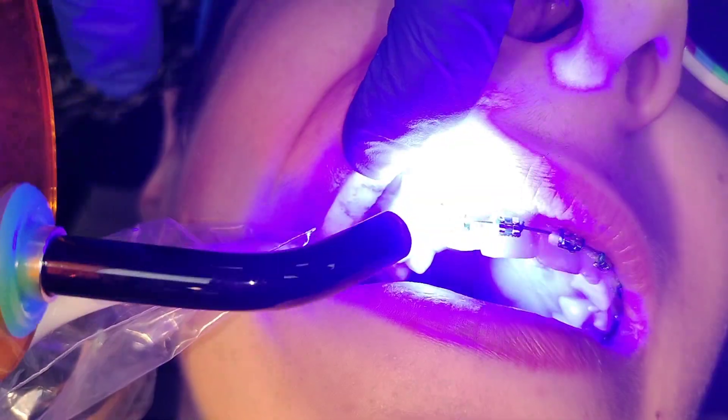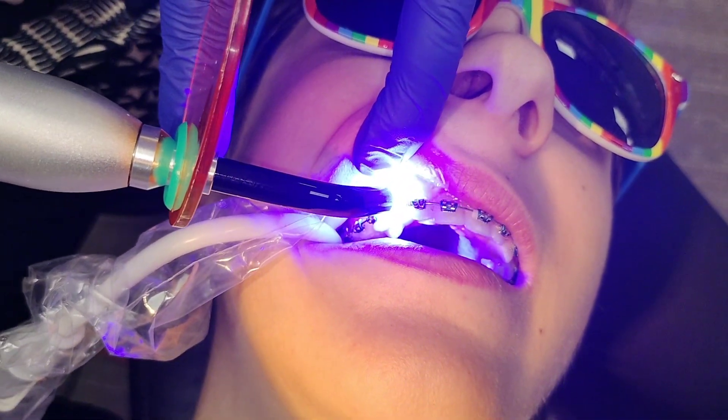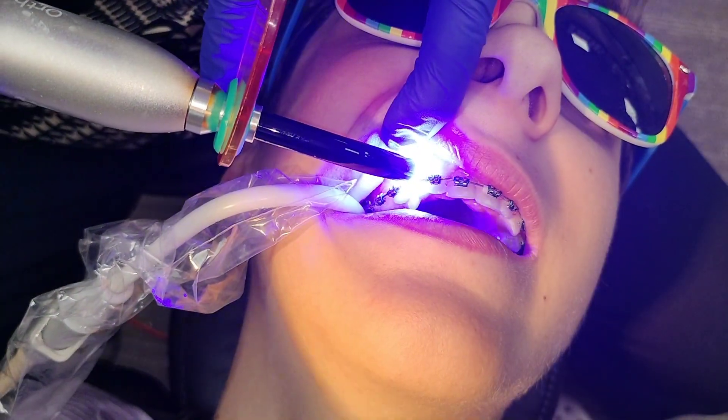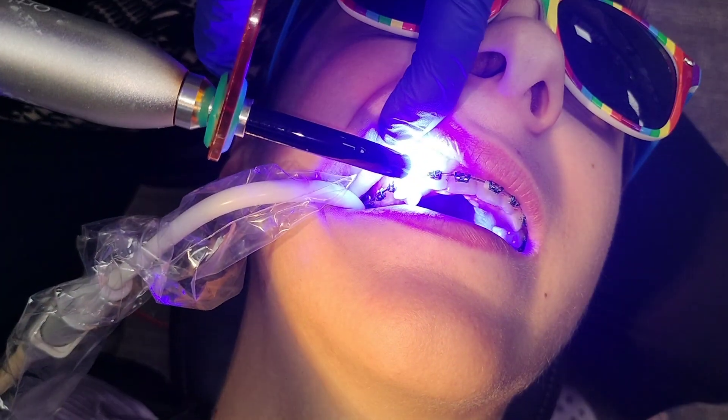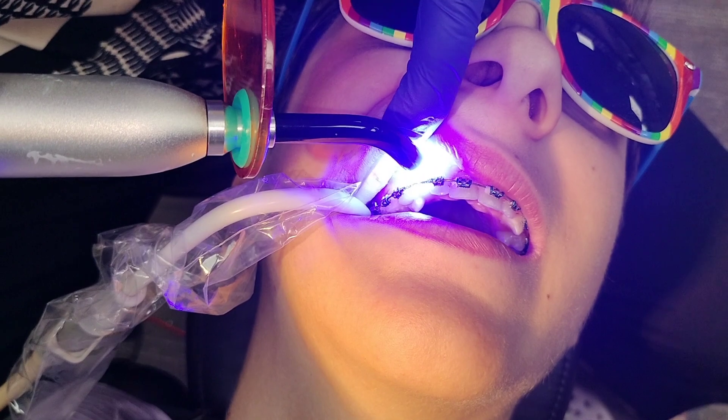And it's done. Good job. We're going to have to put a wire piggyback through it — a flexible wire — so it's going to bring the tooth down into the arch. We're going to put a wire back through the bracket we created, and we'll update the video once we have the tooth in.